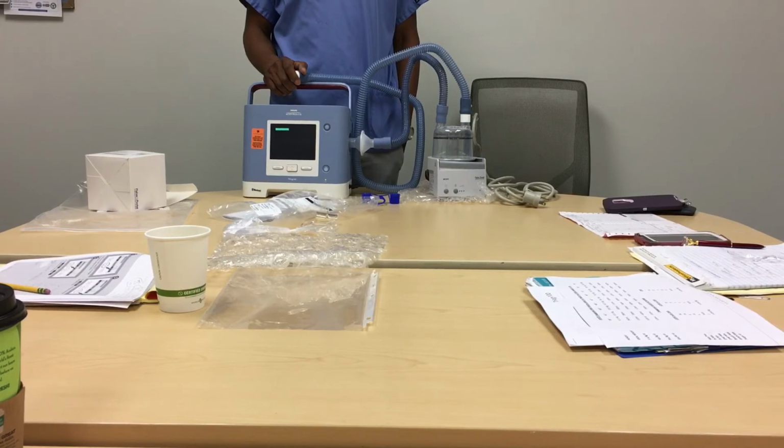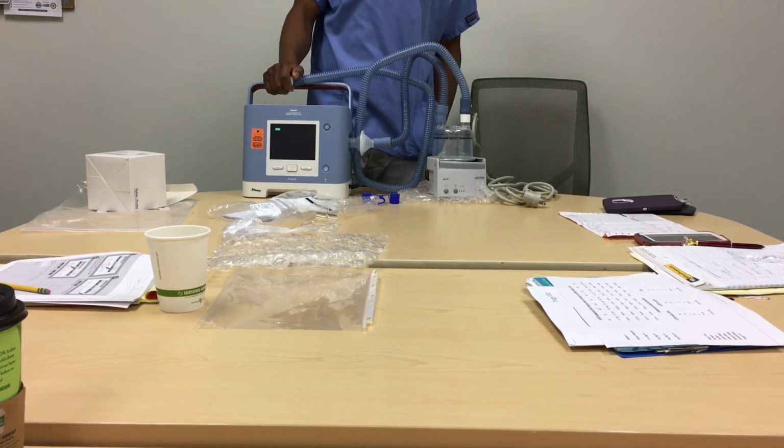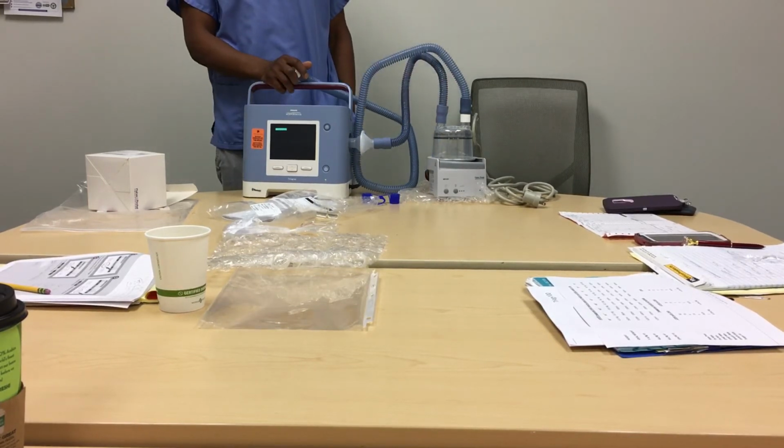Now, when you said HME, my mind went to HMEs for CPAPs and BiPAPs. Are you seeing them? Are you using them? No, because the humidifier comes integrated. Yes, but I'm seeing CPAP HMEs and BiPAP HMEs out there on the market. That is probably off market then. We haven't used it. Yes, you can buy CPAP HMEs on Amazon. You can buy a pack of 50 of them. You can buy anything on Amazon.